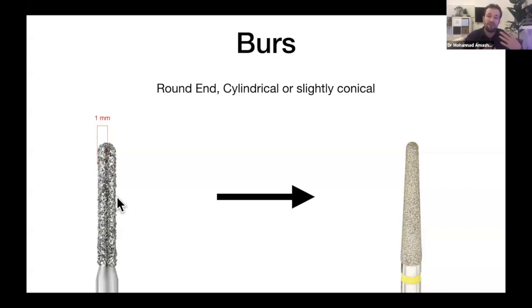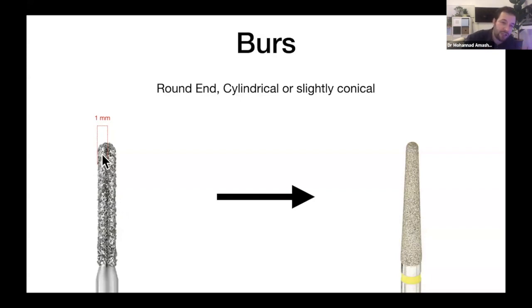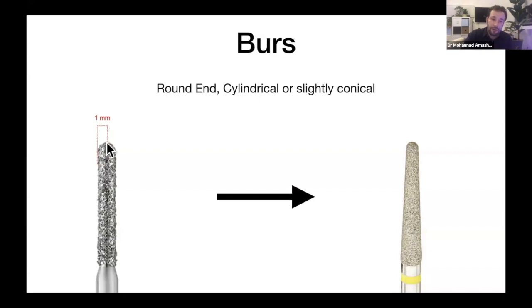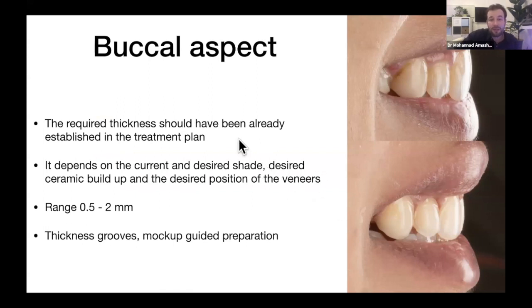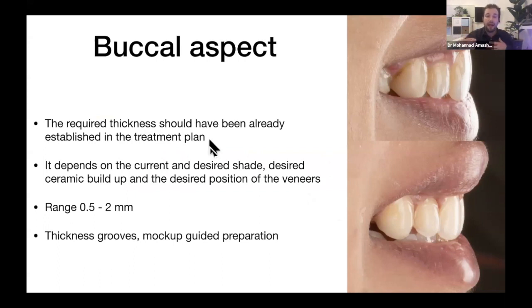I prefer a round-ended burr because preparations benefit from a smooth 45-degree chamfer finish line rather than a 90-degree one, which is harder to finish and communicate to the lab technician. I prefer a chamfer finish line — the science doesn't contradict any finish line, but this is my preference. The burr will only dig halfway through at the finish line to create the outline. I always start with coarse diamond burrs and then polish with yellow or red fine diamond burrs. For the buccal aspect, we didn't prepare excessively because the required thickness was established in the treatment plan.